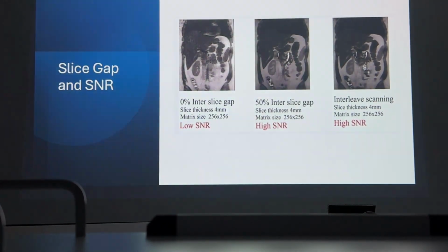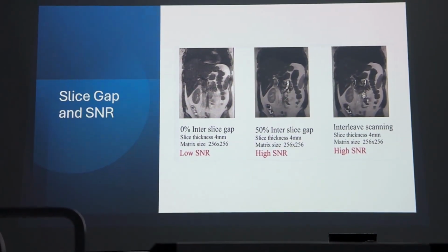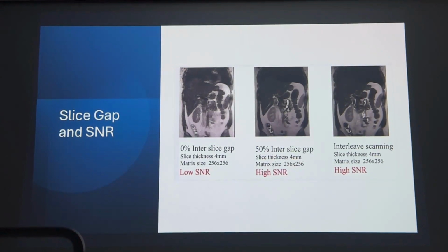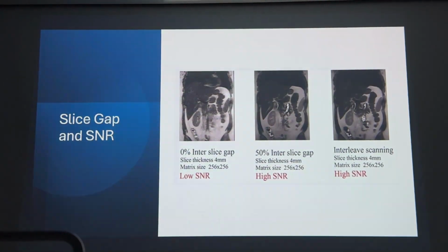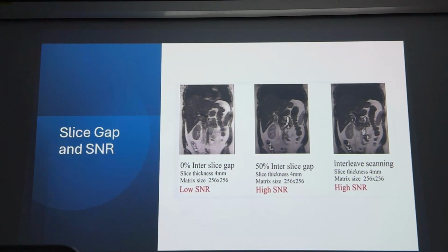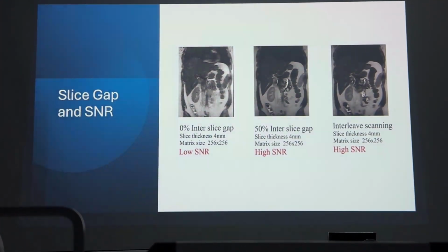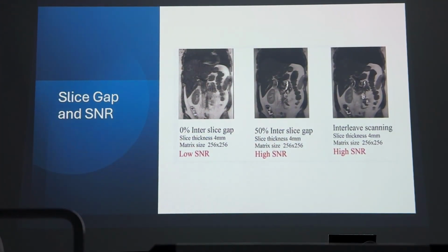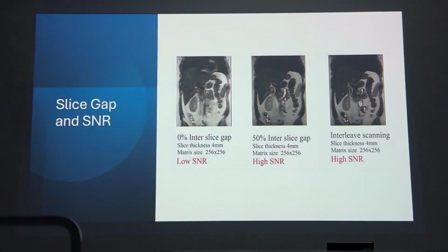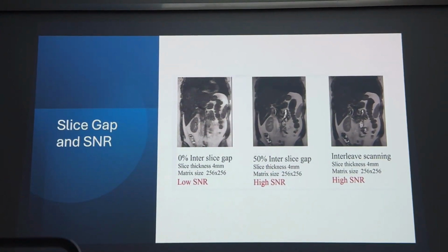We notice when we talk about these factors that "up to a limit" is a very frequent phrase, a limitation for the use of these parameters to adjust or improve the SNR. And we have to remember another important point, that sometimes improving the SNR will increase blurring and reduce image detail regarding the object's anatomical definition and boundary. And always, as an MRI operator, please remember that the time of acquisition is very important to adjust when making your protocol and parameters to achieve a high standard SNR.